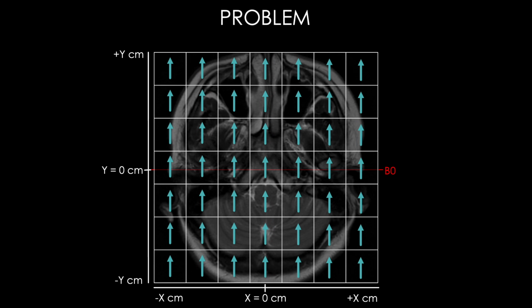We in fact have a bit of a problem here. As we know from previous lectures, we'll be applying what are traditionally called frequency and phase encoding gradient magnetic fields across the x and y axes in order to produce our picture. Let's look at what happens to the magnets within each voxel when we apply these gradients. Let's apply this gradient field g of x across the x-axis, say for 1 millisecond.